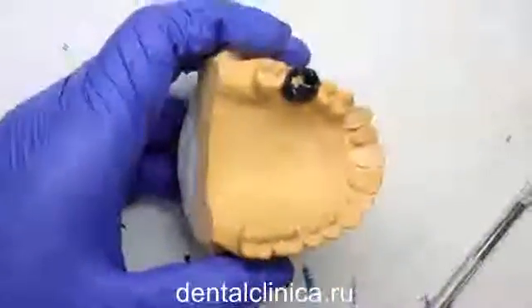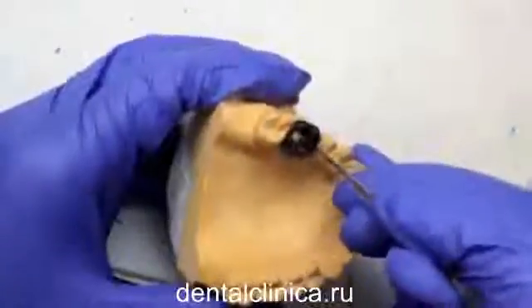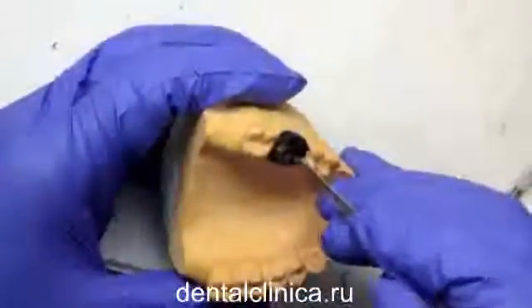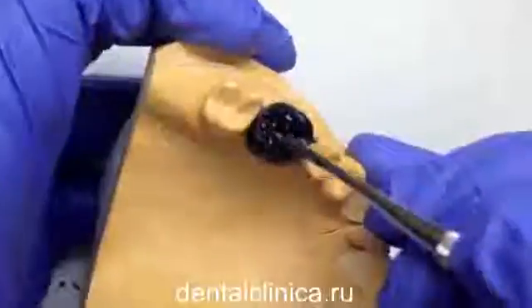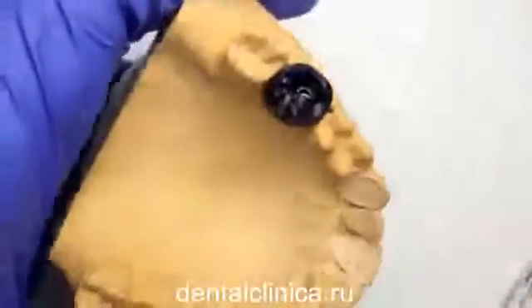Now it is time to fill the fish mouth with wax. You could do this by pooling it in the center, or slowly creating each triangular ridge. Once the fish mouth has been filled, the basic structure of the molar should be seen.